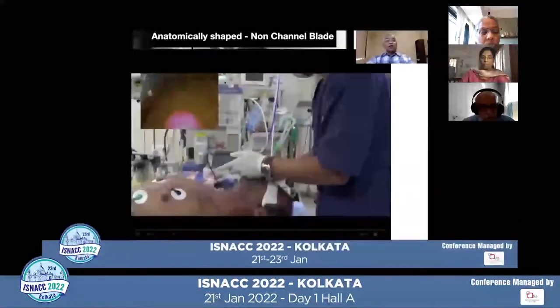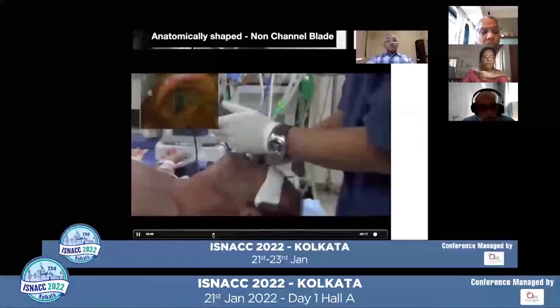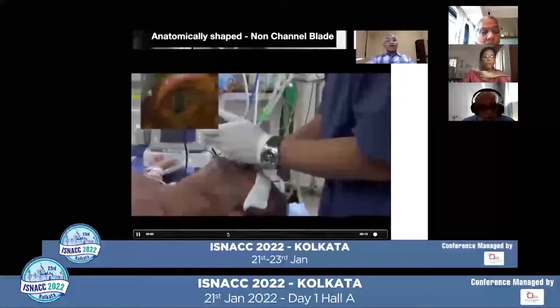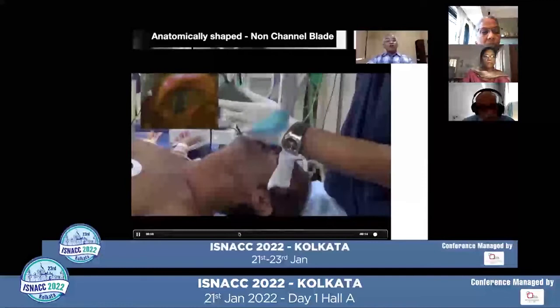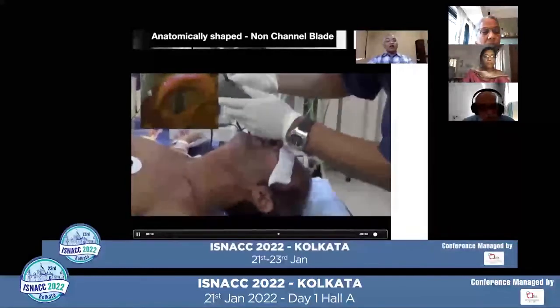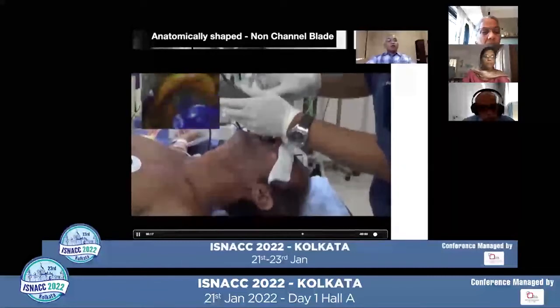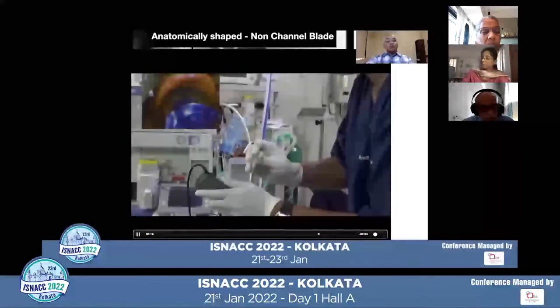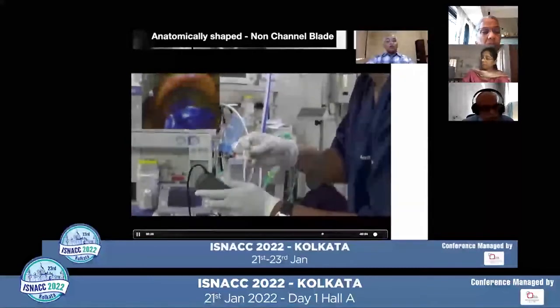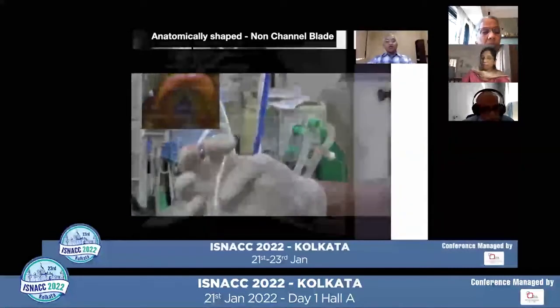So here, if you look carefully, I have introduced this CMAC D blade. You get a fantastic view, and once you introduce this hyperangulated stylet-loaded endotracheal tube from the corner of the mouth and reach the larynx, carefully observe my fingers. I am only pushing the endotracheal tube without the stylet. It is essential that you push only the endotracheal tube.